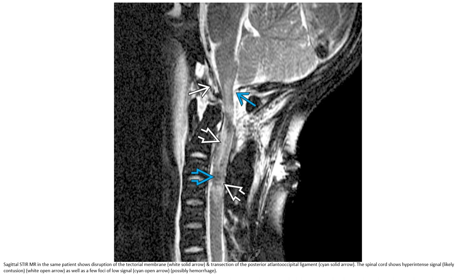MRI in the same patient shows disruption of the tectorial membrane and transection of the posterior atlanto-occipital ligament. The spinal cord demonstrates hyperintense signal as well as foci of low signal.